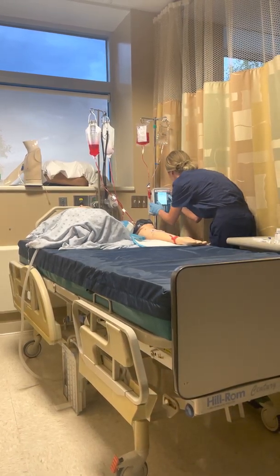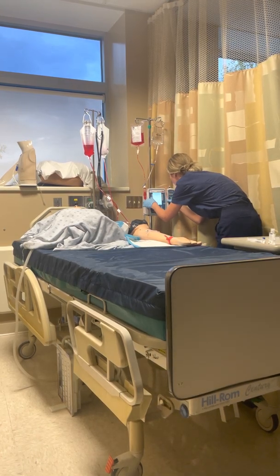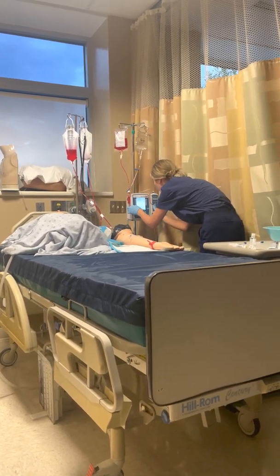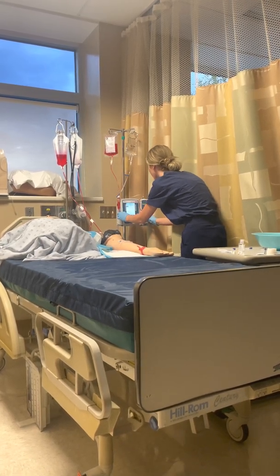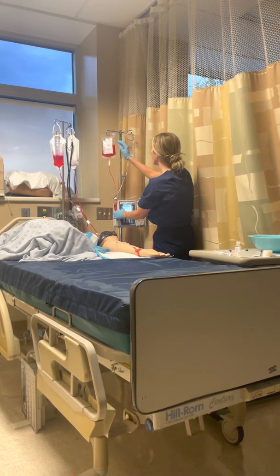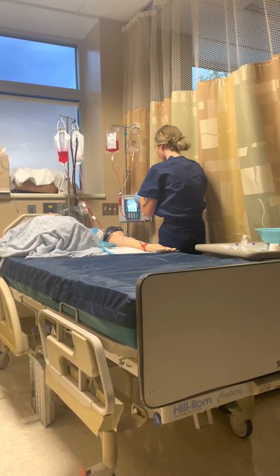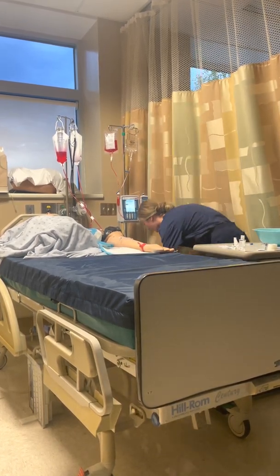All right, so you are not a new patient here with us today. We are on the adult ICU. Channel A will select. These are guardrail fluids, and the component is red blood cells. Yes, this is correct. And the order is to be infused at 50 milliliters per hour, and there's 250 milliliters in the packed red blood cells, and I don't want it to run completely out on you, so I'm going to set it to 225 milliliters. So that's all set up, and then I am going to clean your IV site off here.